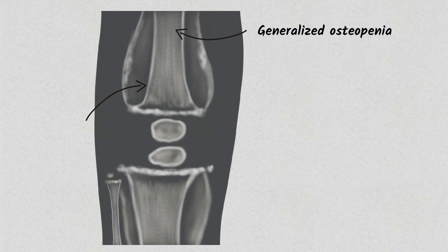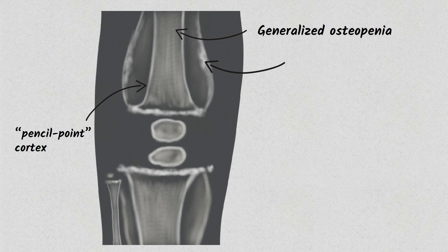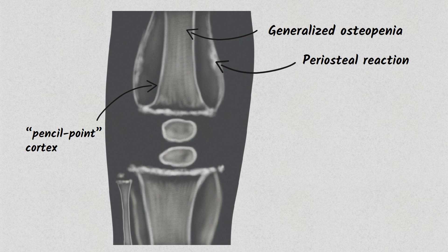And here this is periosteal reaction. It is due to subperiosteal hemorrhage. Here you can see dense zone of provisional calcification which is called Frankel line.